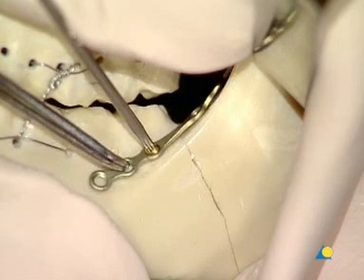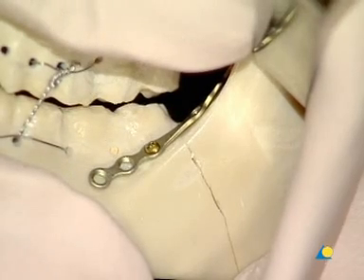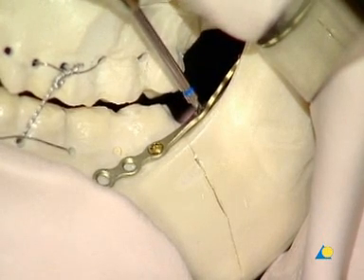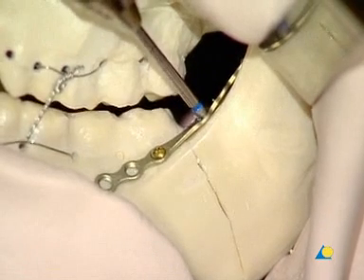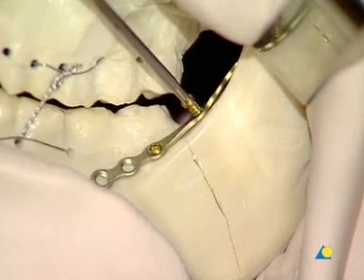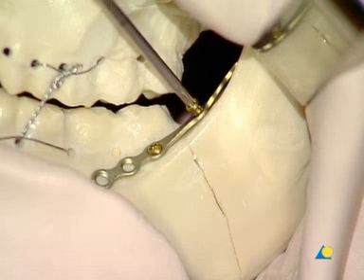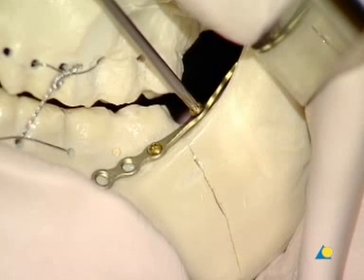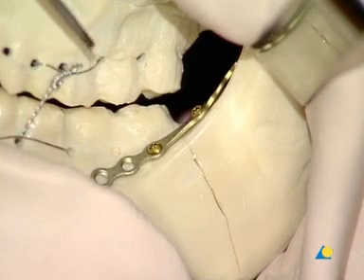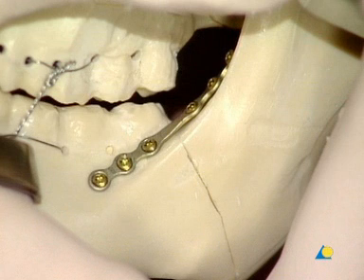It's also possible to place the first screw into the proximal fragment, to allow for reduction of the condyle-bearing fragment with the help of the plate. Another hole is drilled on the other side of the fracture line. The second 2 mm screw is inserted. The remaining plate holes are filled with screws, and they are all fully tightened.